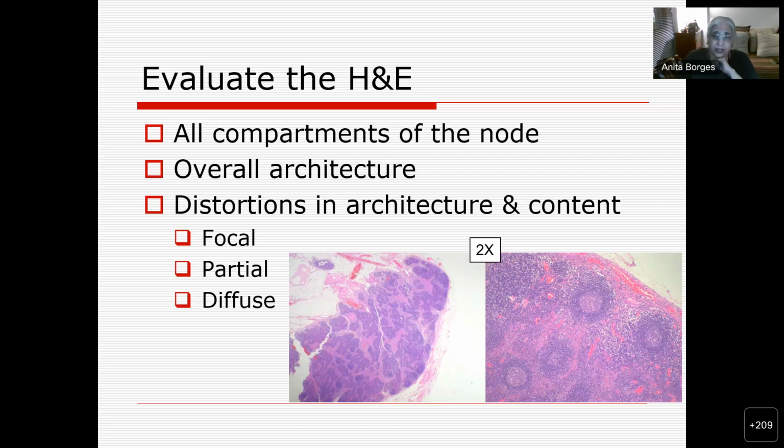The lower grade lymphomas will show you very little change in architecture, though the cell content is changed completely. It is replacing what you would expect in a normal lymph node, but the architecture, the sinuses, may be a little compressed by the burgeoning cell content. So the walls may be bulging, the roof may be bulging, but the basic architecture has not entirely been changed or destroyed.